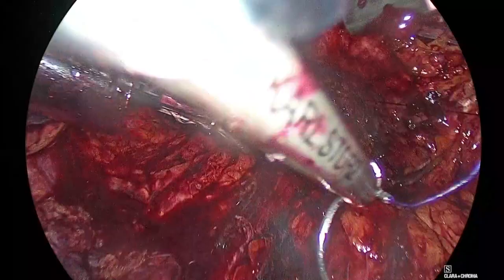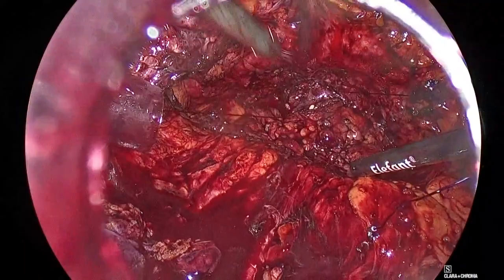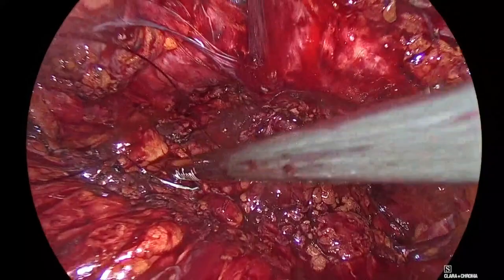Show me down here, Padeli. Look, is this? Be careful. This is bowel here. Stay there. Okay. Protect this, Panagiotis, with your suction. Yes. Now I go in with my other suture. So all these are moves that, when you do a continuous suturing, it's nice to have a protection of your other suture. Leave it. You just protect your other suture, Panagiotis. Good. Come in.